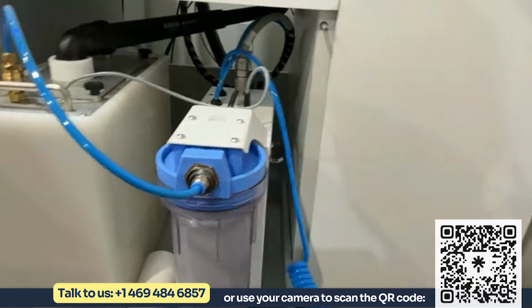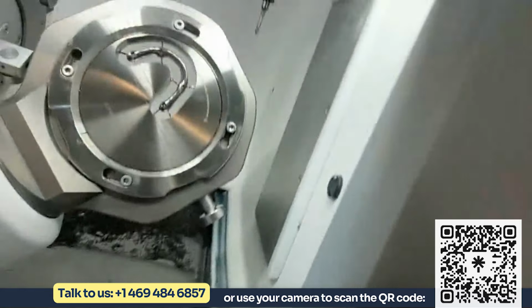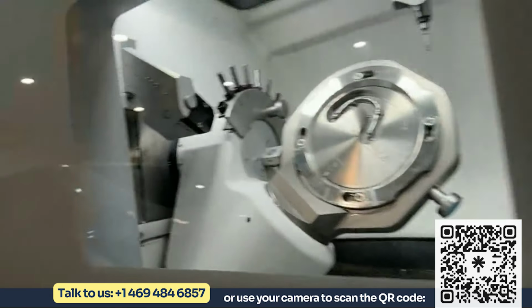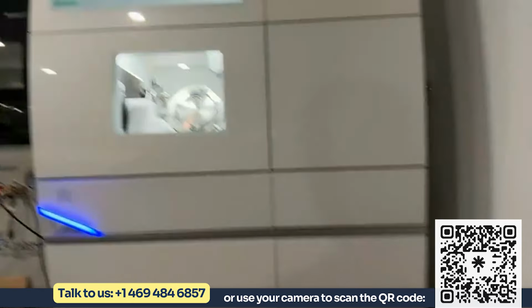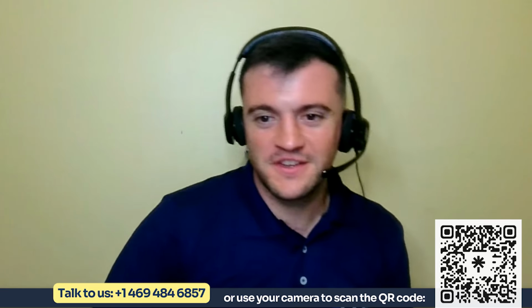There's also a water gun here, which is really useful. After milling all that metal, there are some metal shavings in there that I will go in and hose down with the water gun. Other than that, it's just a milling machine. Other than the last 30 minutes talking about it, it's just a milling machine.